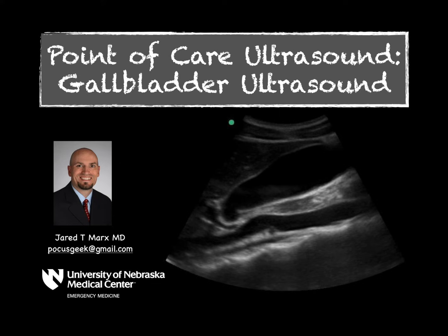Welcome to POCUS Geek. In this video, we're going to review normal anatomy for the most part of the gallbladder and the scanning technique which I teach to my residents and staff for looking at the gallbladder in order to not miss anything. If you haven't had a chance, I would recommend looking at the pathophysiology lecture in which we talk about how this develops. I think that helps you understand and better perform this study when you focus on what you need to with imaging the gallbladder.